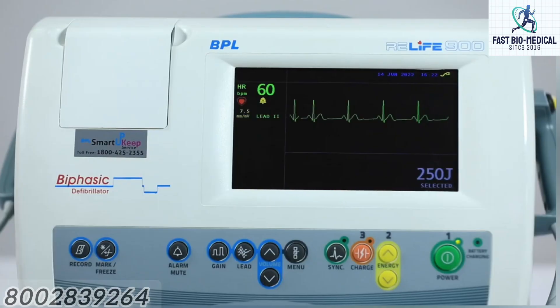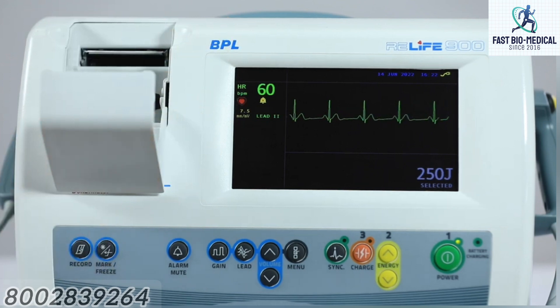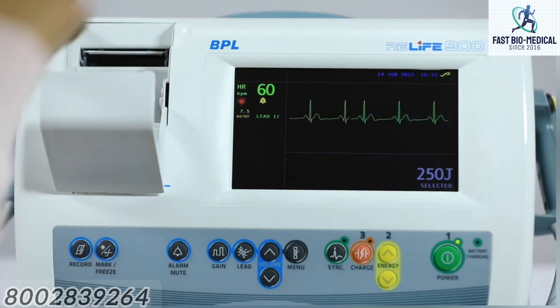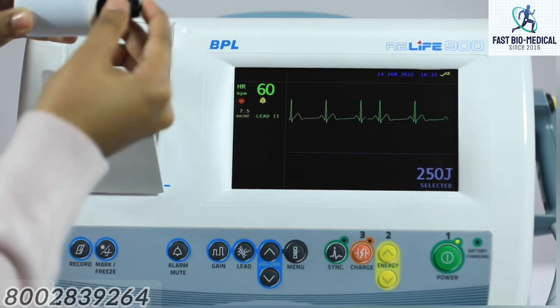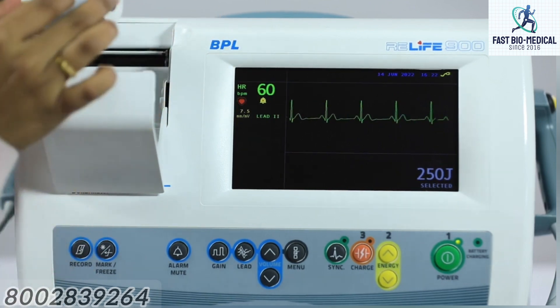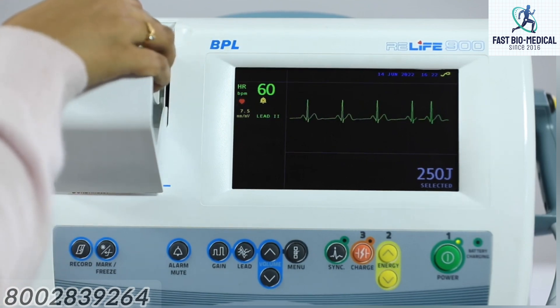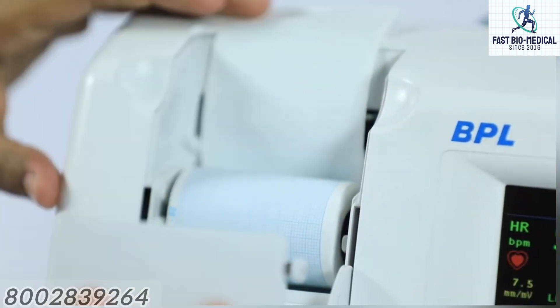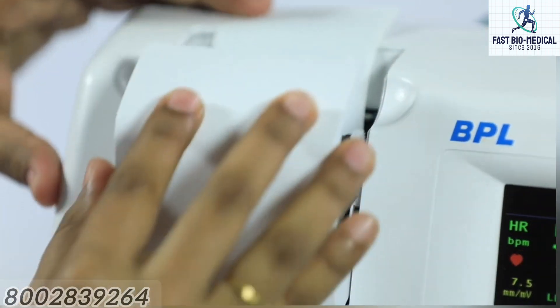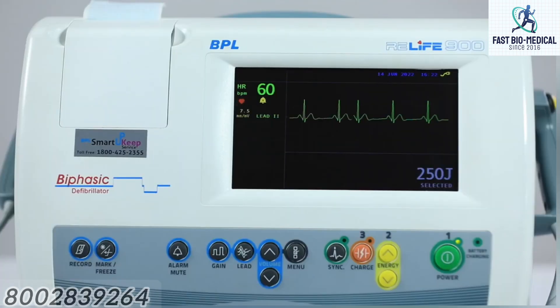Loading the thermal paper: this defibrillator uses 58 mm white thermal paper roll. To load the paper roll, pull the printer door forward to expose the rubber roller. Insert the paper spindle into the roller and place it on the groove provided inside the printer compartment. Ensure that the grid surface of the paper is facing the thermal printer head, then pull the free end of the paper until it comes out of the printer compartment.